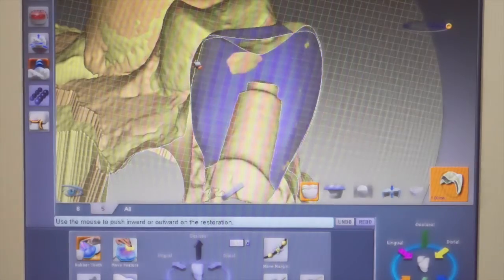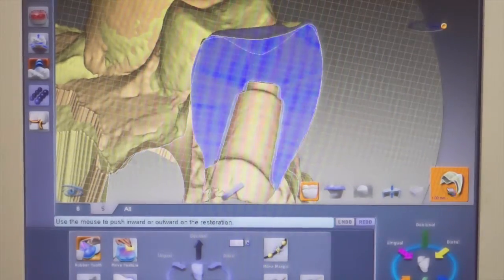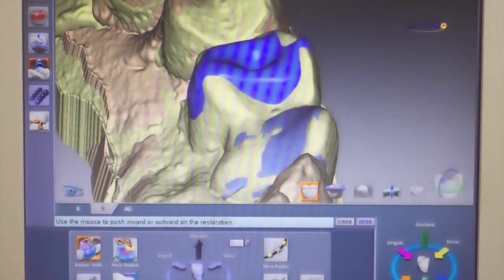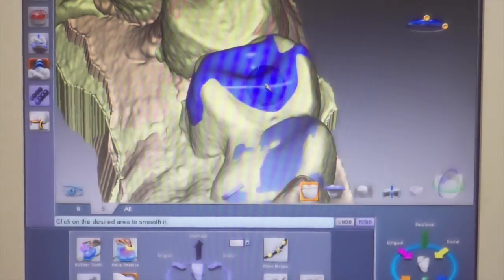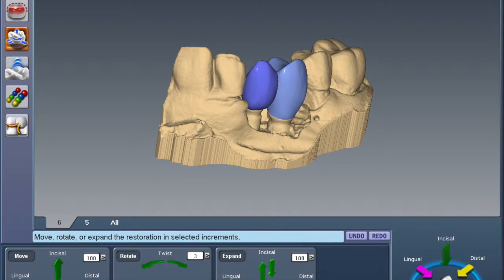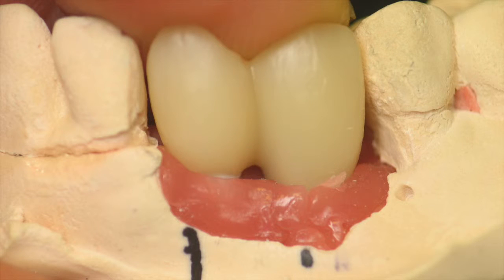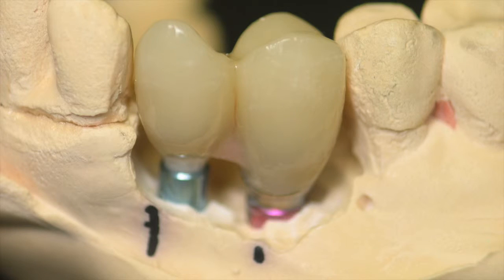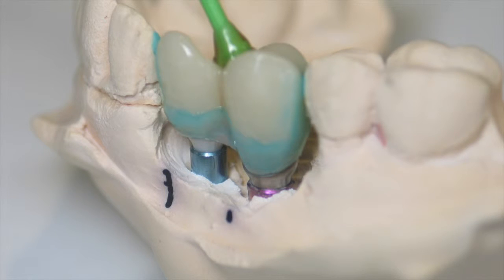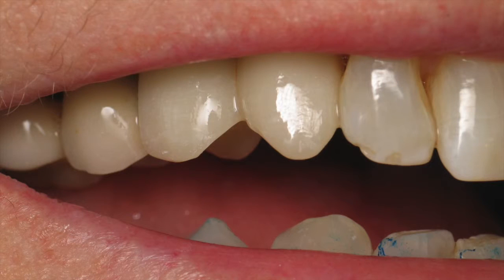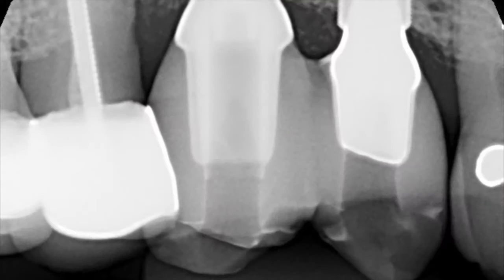In areas that don't seem to conform well we can manipulate with rubber tooth, but if you try to do all your design with rubber tooth and slice plane you're going to end up with a ripple effect, and that's why it's important to bring in smooth tooth to help give you a more even design. So when the design is complete we mill it, try it in on the soft tissue model after crystallization, stain, glaze, and in this case add a little pink porcelain, prepare it for cementation, and then cement it on the model. The last blog goes into much more detail on this. Try it in the mouth and make any adjustments, and then torque it down.